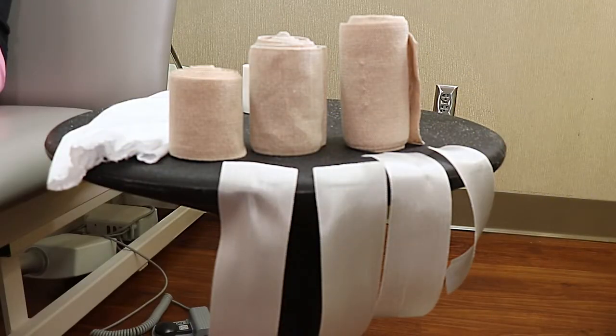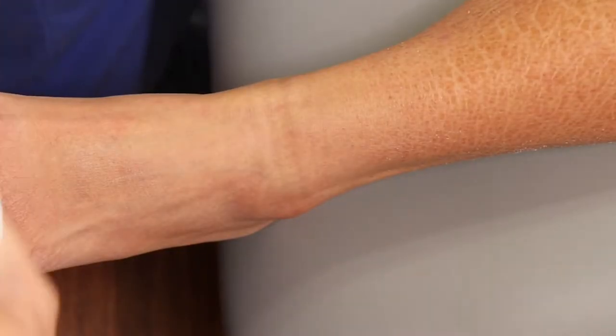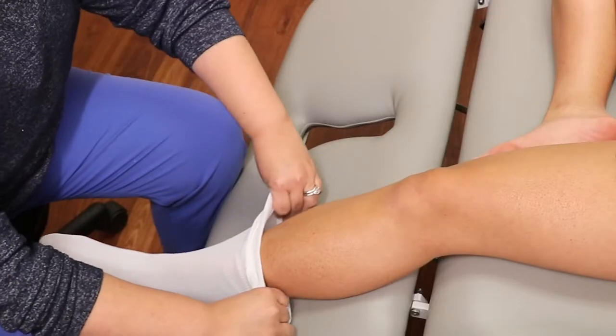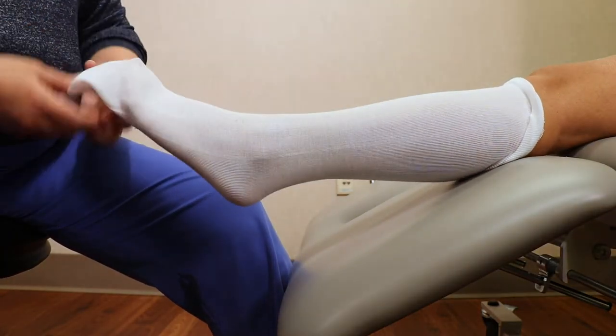Have the bandaging supplies ready that you and your therapist have discussed, including your liner, which you will apply to the leg just like a sock. Use the liner that you and your therapist have discussed.